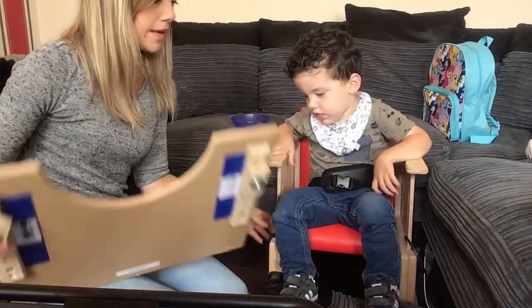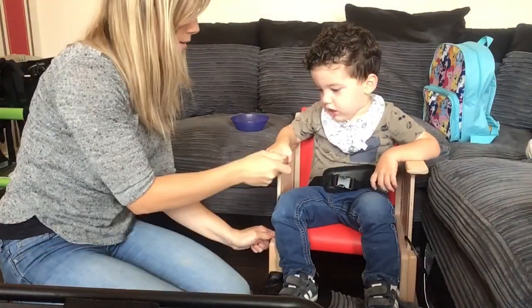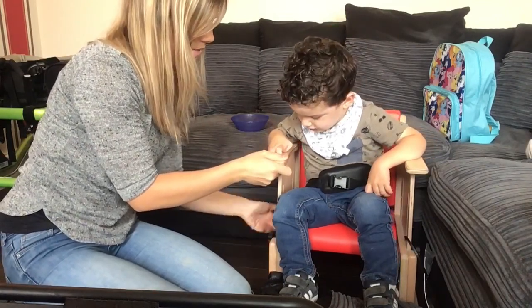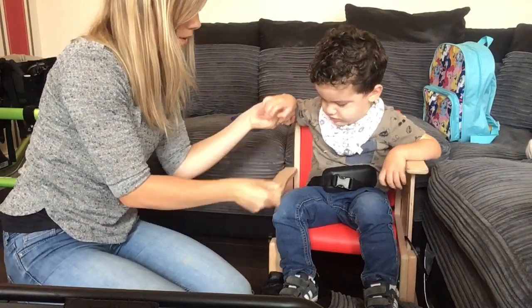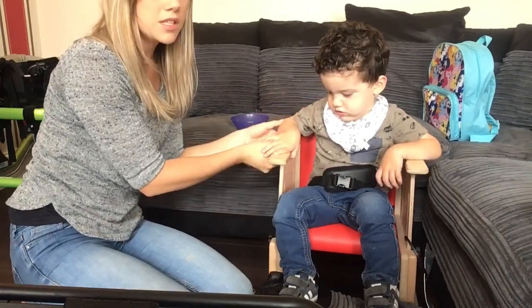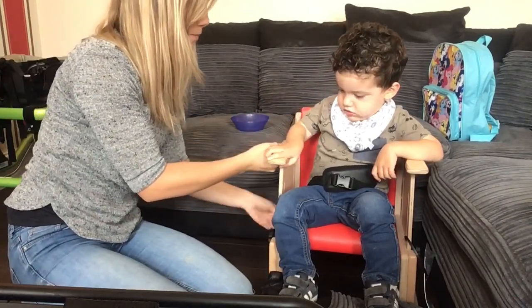These move up and down as well. You can move it up and down as much as you want. I've got it as high as it goes just for that extra bit of support for Wilson.